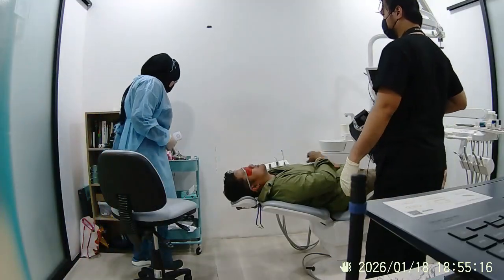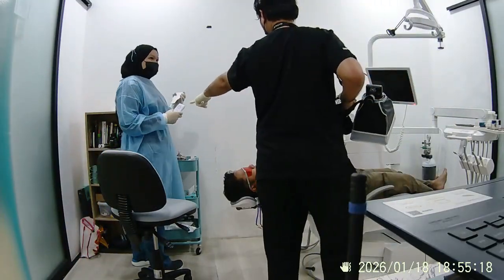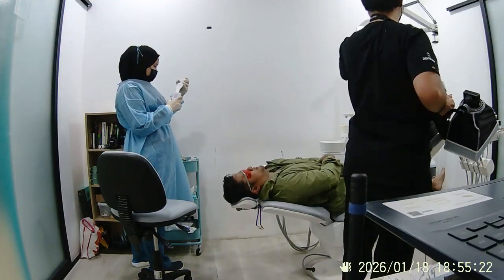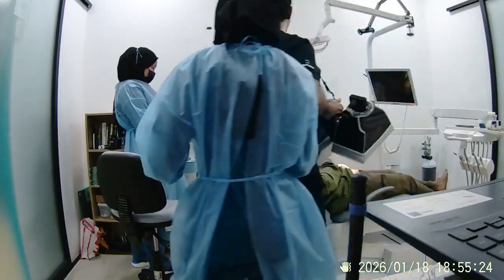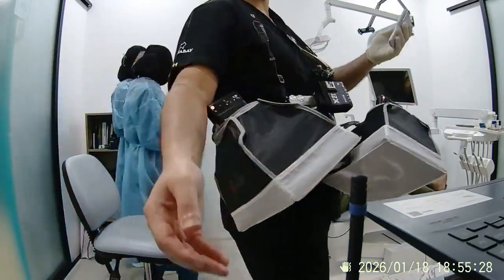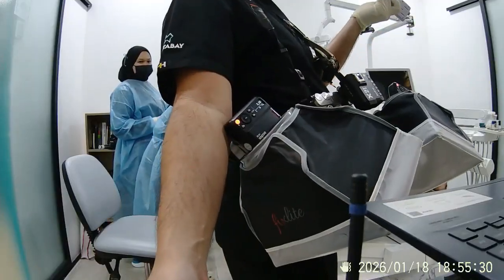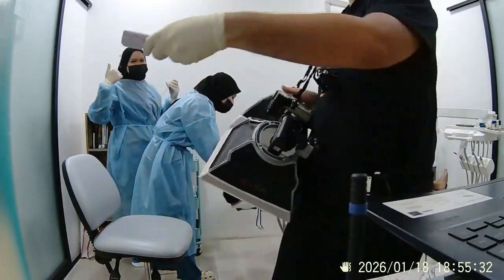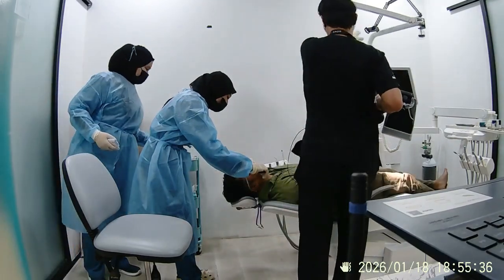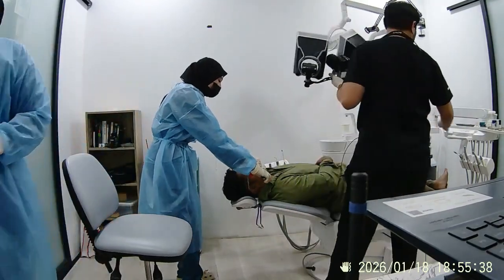So this is real dentistry. Okay, this is unedited and unscripted. Basically, the battery for the special mirror is kaput, fully drained. So we use the overhead light to provide the necessary light to help the camera sensor pick up and take the photos, for the occlusal photo especially.